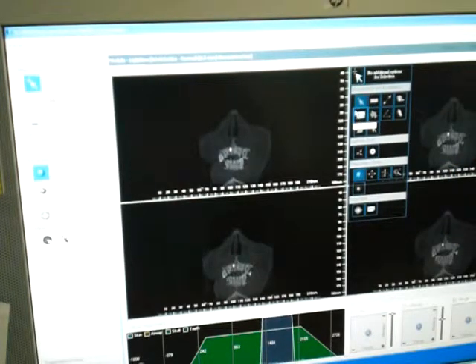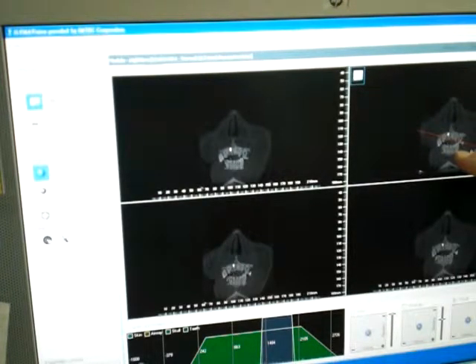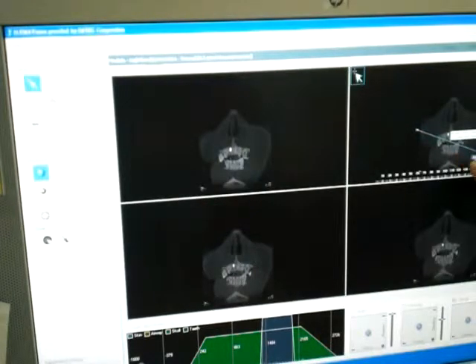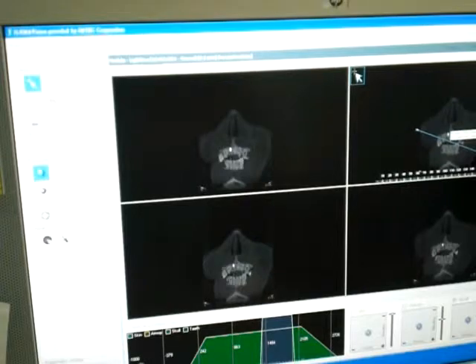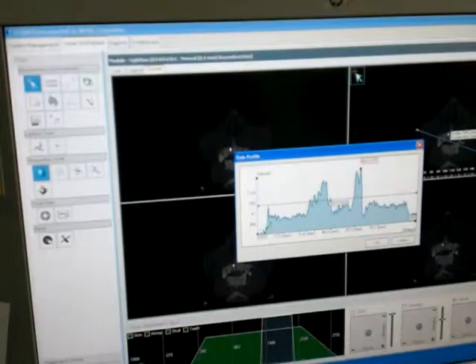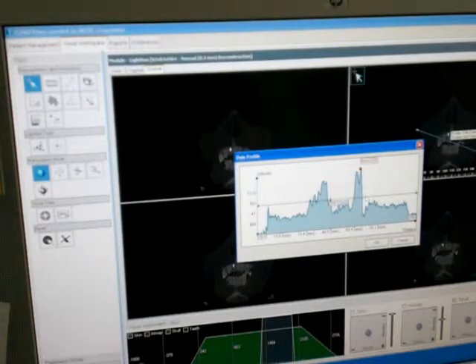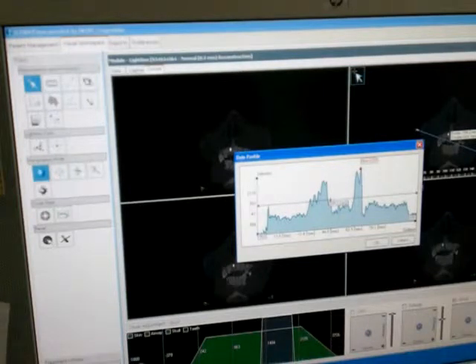This tool is 'Create Profile.' You draw a straight line across the area — for example, across the bone — and then double-click to finish. It generates a profile graph in Hounsfield units. Hounsfield units represent bone density, so you can actually assess bone density using this tool.